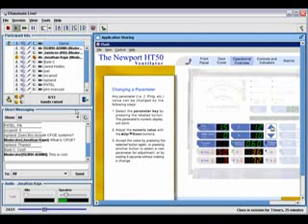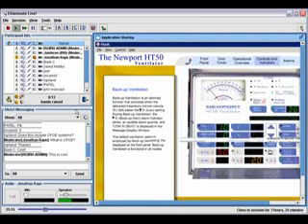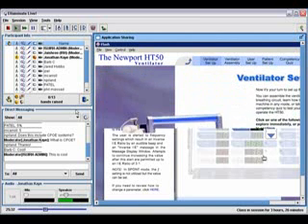So if I go here, I can change the volume control level. I can change it to pressure control, and it reverted back to 600 milliliters because I didn't confirm that. Here it's asking me to increase the frequency to 12. Actually, I went to 15. But the idea here is that we walk through all the different parts as this kind of tour, where we're actually operating the machine and getting the feedback as to what the consequences would have been if we do it correct or incorrect.